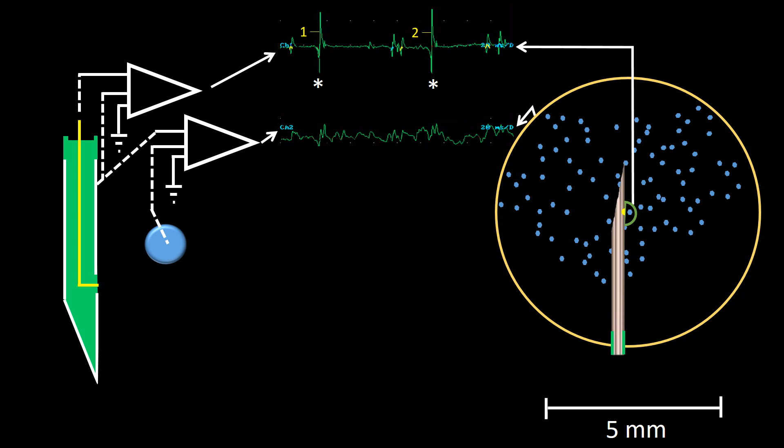As you can see in this new frame I have labeled the prime muscle fiber potentials 1 and 2. Notice that I have introduced a triangle with prime potential number 1 at the vertex. I have done so to indicate the time span of the lower tracing to be used for averaging in relation to the number 1 prime potential.